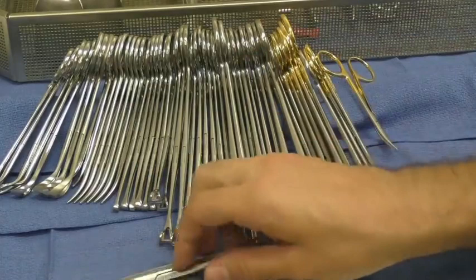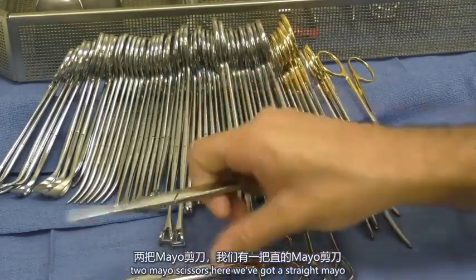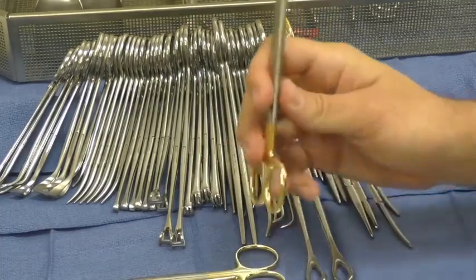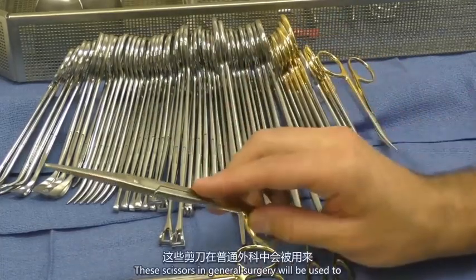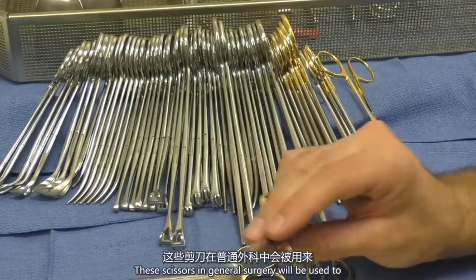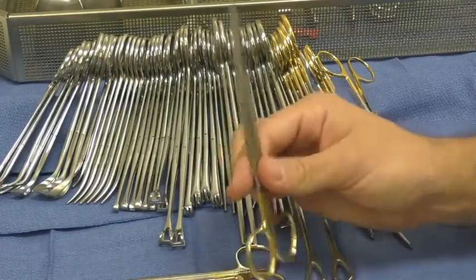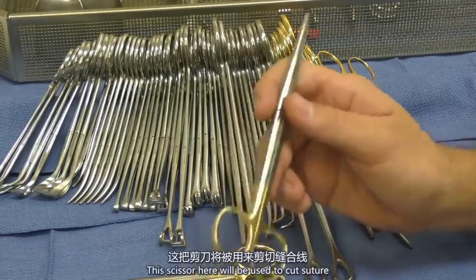And now we have 2 Mayo scissors here. We've got a straight Mayo and a curved Mayo scissor. These scissors in general surgery will be used to cut suture across the bar. This is your suture cutter. This scissor here will be used to cut suture.